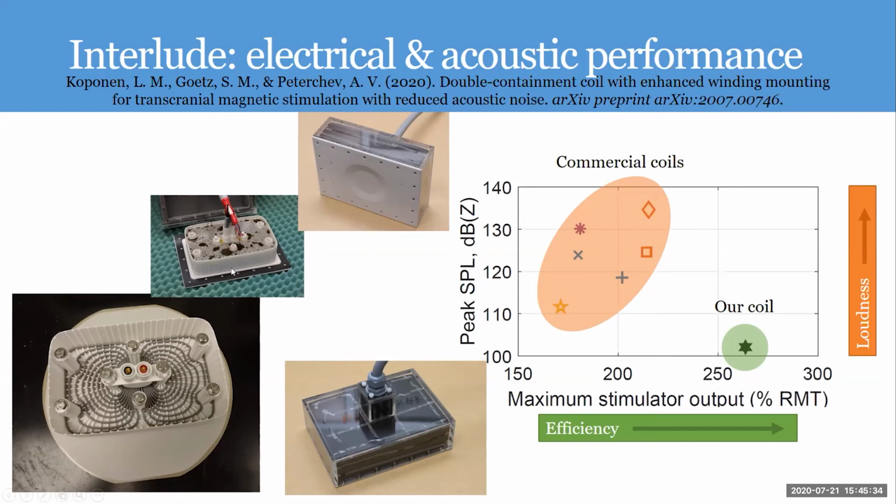So here, the attenuation from even this, with atmospheric pressure in that gap, is on the order of 30 to 40 decibels. So you need to actually go to millibar scale, to medium vacuum. And if you go to medium vacuum, you cannot have a thin plastic window like this, because it would be pulled into the coil, and of course then there would not be vacuum. So you would need to add distance to the scalp and then power by a factor of probably 4. So then it becomes a competition against whether you become too inefficient to actually stimulate or not.